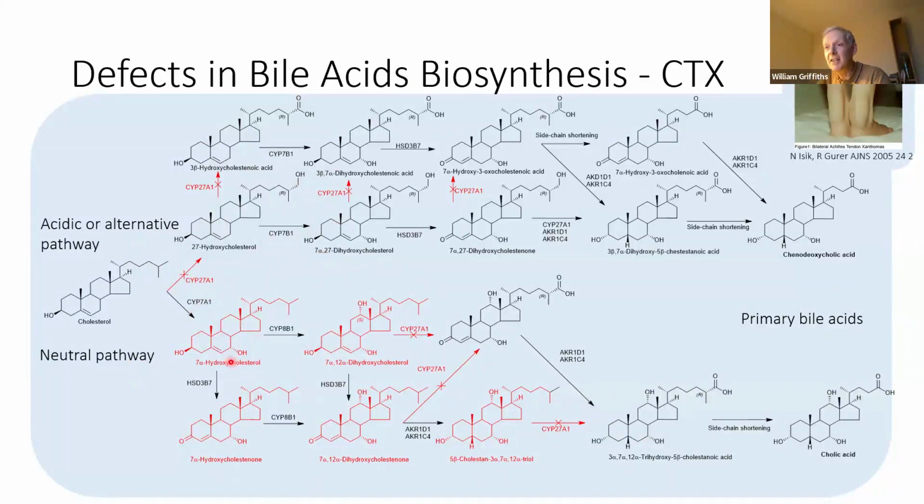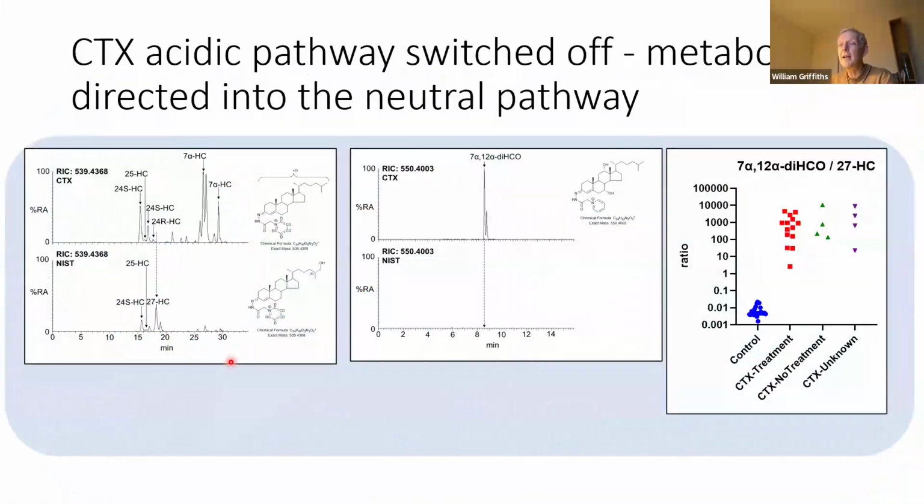So actually, you'll see diagnosis can actually be quite simple. So here I show that with a couple of chromatograms. At the bottom, we've got a control chromatogram. In the top, we've got a CTX chromatogram. This is from plasma from a patient.